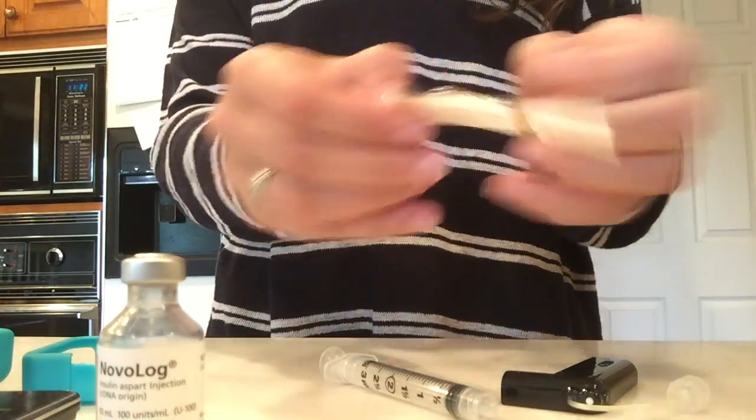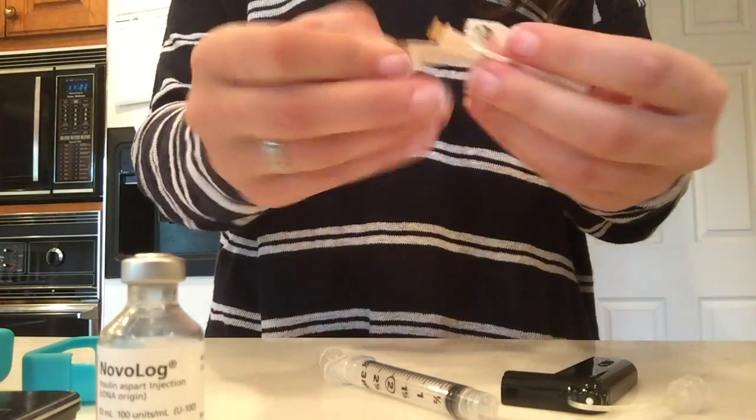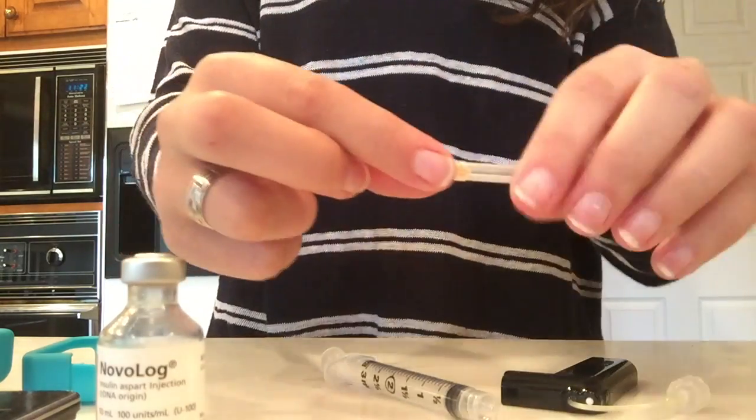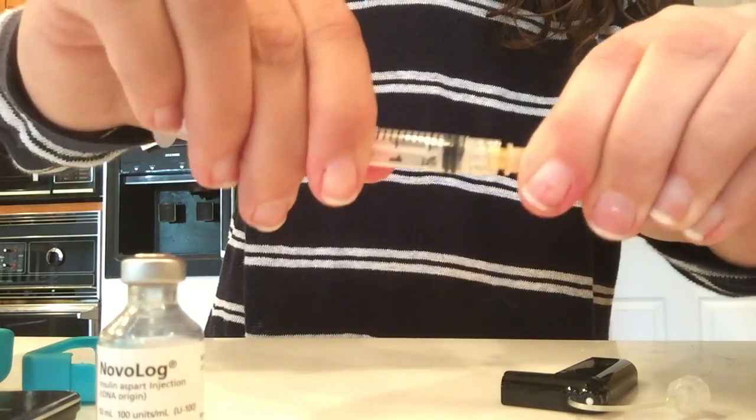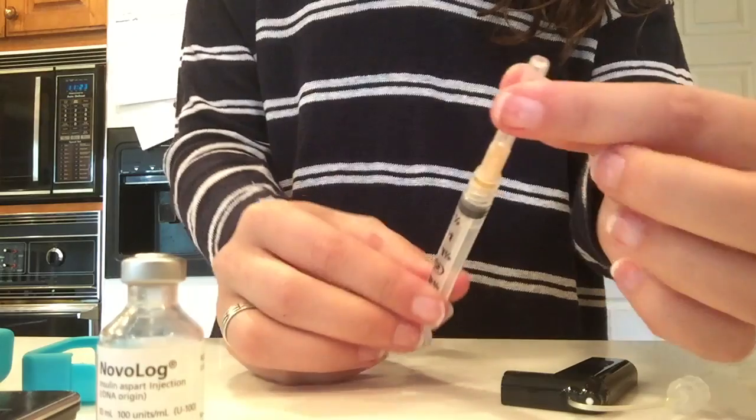Then here comes the needle, which detaches. We're just opening all that up and then you take the needle and your syringe and it just twists on there. Make sure it's super duper tight so it doesn't come off.